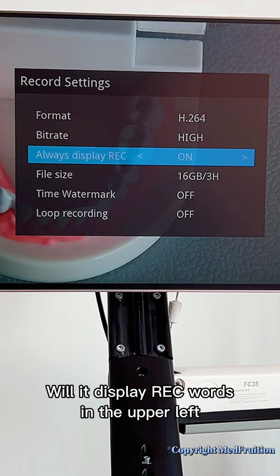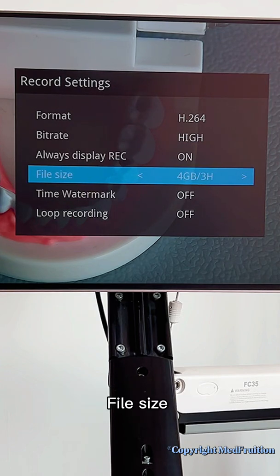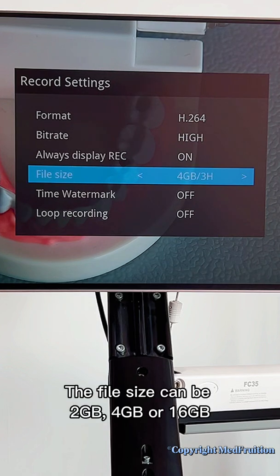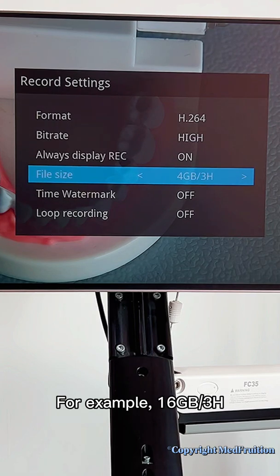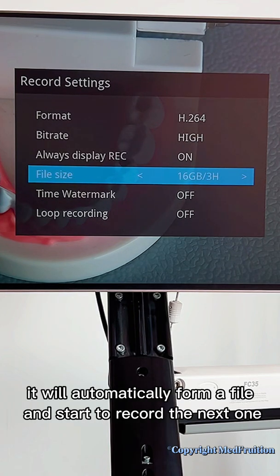Always display REC — this controls whether the REC indicator will display in the upper left. File size: our maximum video duration is three hours. The file size can be two gigabytes, four gigabytes, or 16 gigabytes. For example, with 16 GB and 3H set, when the file reaches 16 GB or three hours, it will automatically complete the file and start recording the next one.